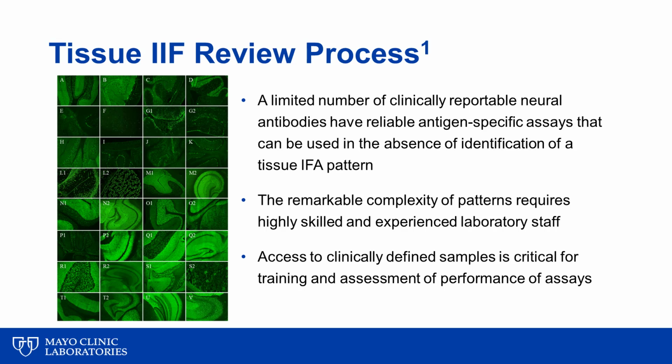Similar to biopsy tissue examination in a pathology laboratory, where a critical diagnosis may rest on the pathologist's interpretation, the improper identification of neural antibodies can have severe consequences, such as missing a treatable or even curable disease where there's a limited opportunity for intervention.